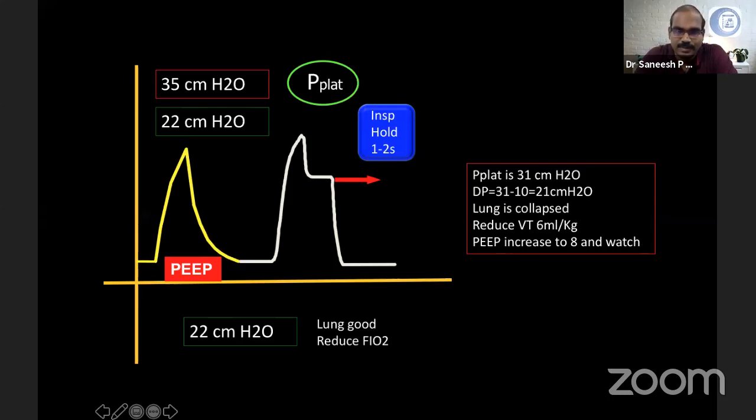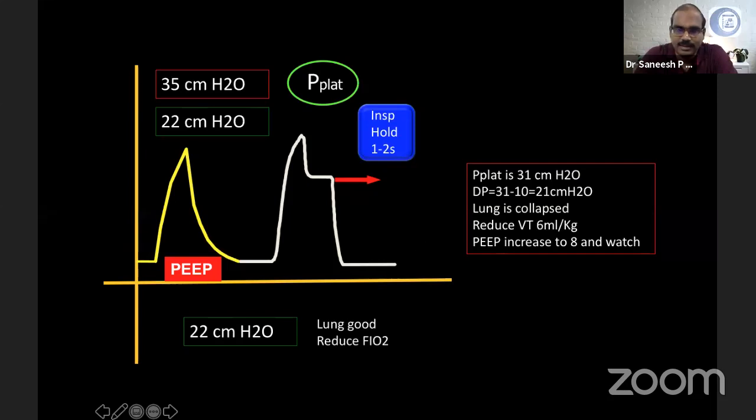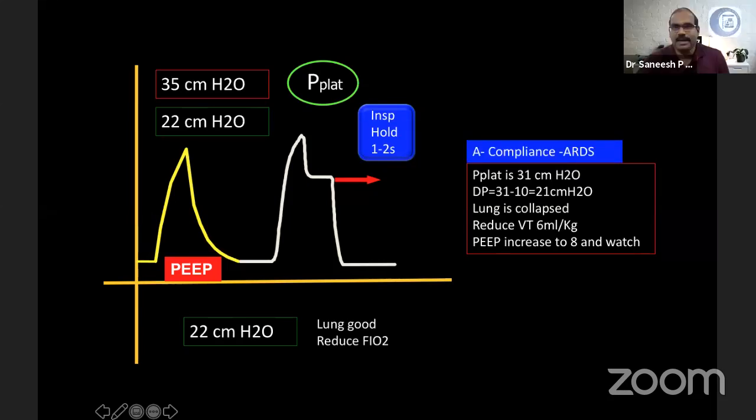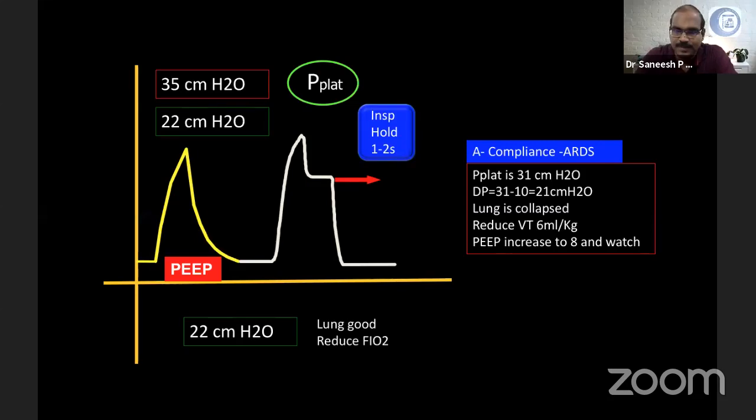Yes, sir. Okay, initially we tried for a tidal volume of 7 mL per kg. Now you come down some more, and probably that margin you can use for PEEP because of hypoxemia. So we are discussing a separate scenario. First one was reduce the tidal volume, increase the PEEP. So this happens in something like ARDS. Yes, sir. Sepsis. So we have to uptitrate PEEP, go for a reduced tidal volume.